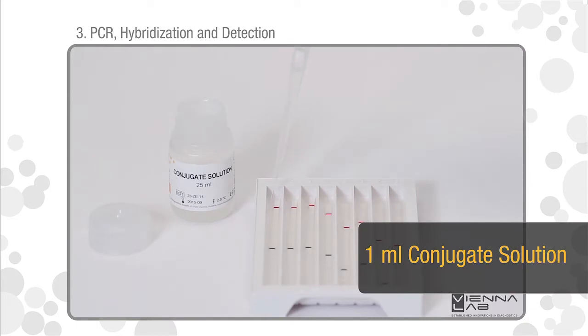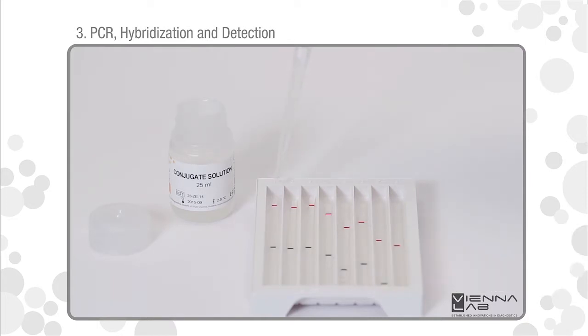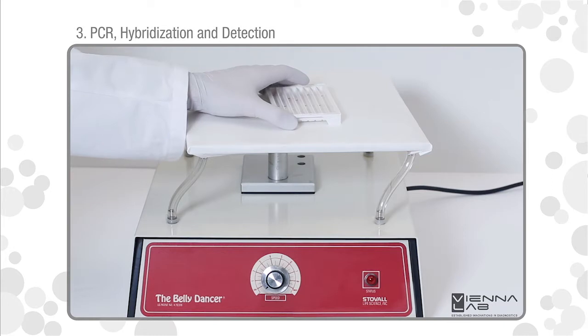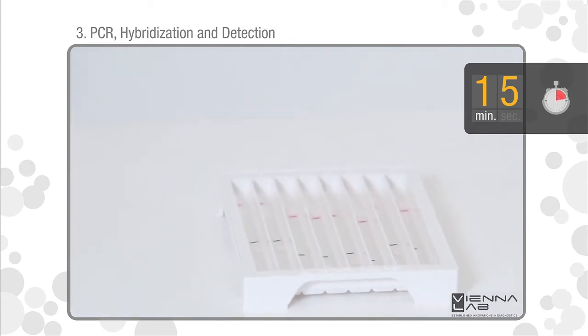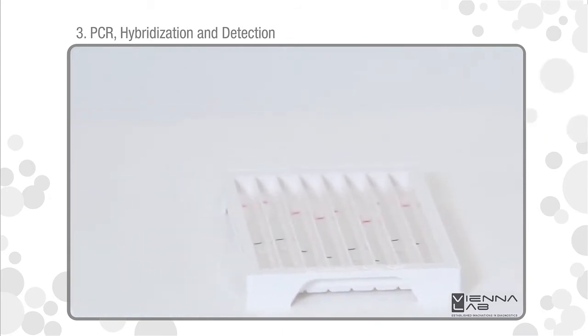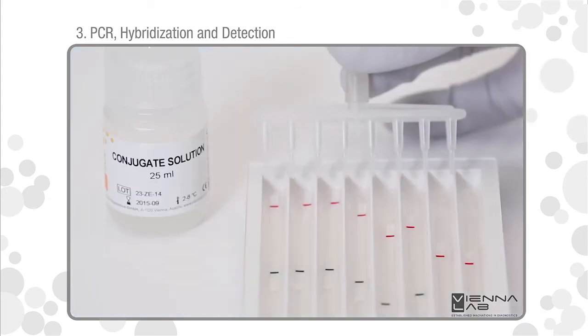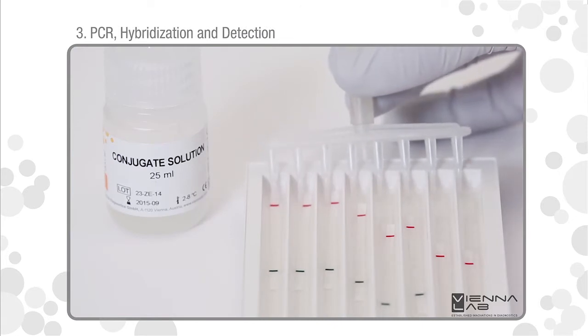Add one milliliter conjugate solution. Incubate for 15 minutes at room temperature on a rocker or orbital shaker. Remove liquids by vacuum aspiration.